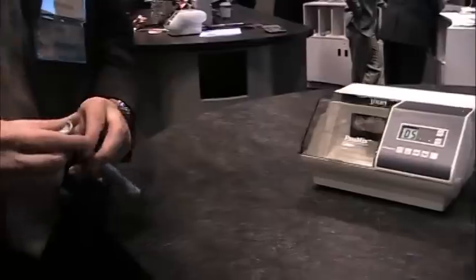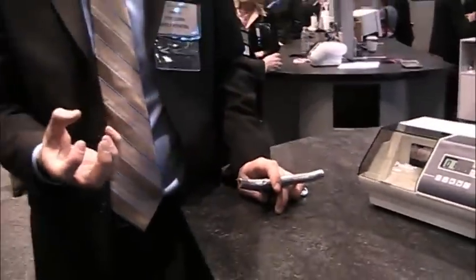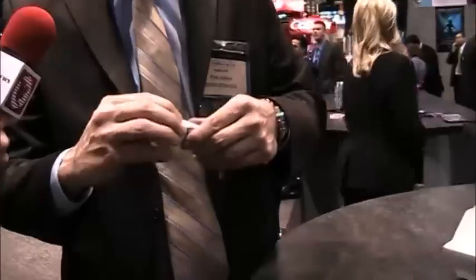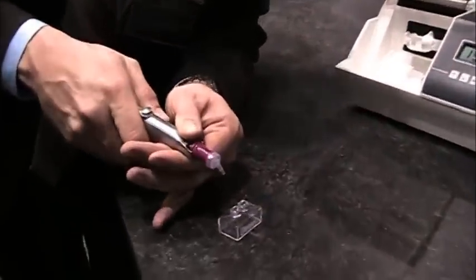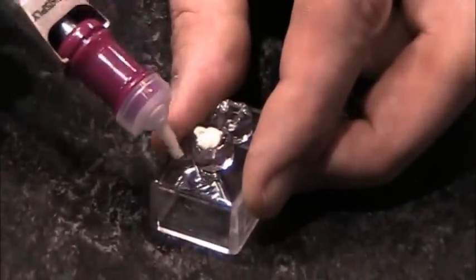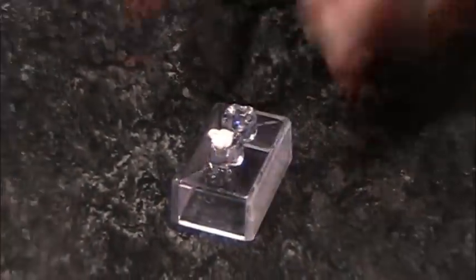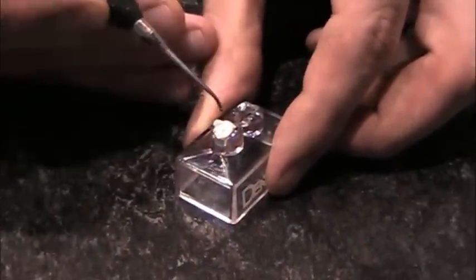A big thing about glass ionomers is that a lot of them are really sticky right out of the amalgamator. You'll notice with ours, after it's triturated, you put it right into your extruder and extrude it right into the prep. They'll also be able to manipulate the material right away as it won't be sticky off the bat, which is key. The dentist gets it in there and right away, using their instrument, they can start carving anatomy — and you can see that it doesn't pull back.